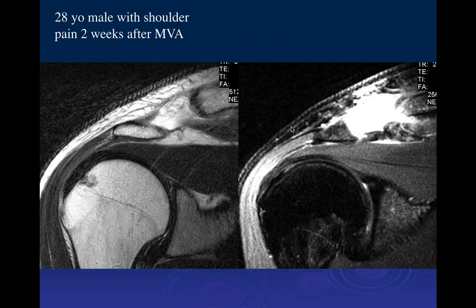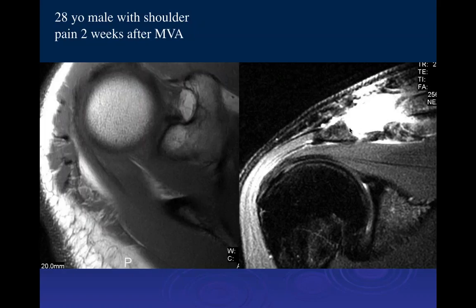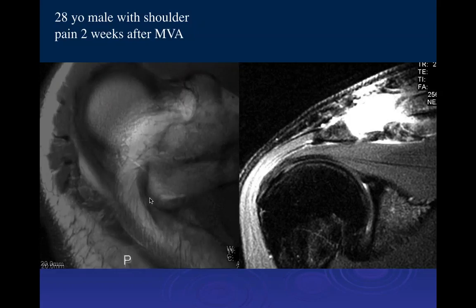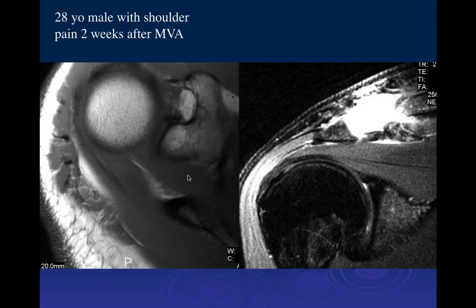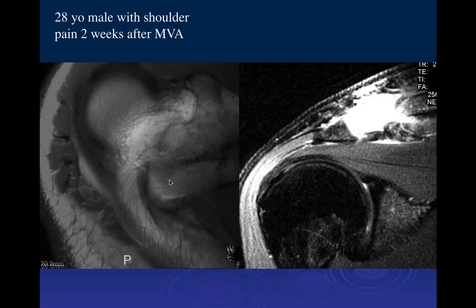There's a lot of edema at the distal clavicle at the AC joint, and on the coronal plane the distal clavicle appears posteriorly displaced. On the axial T1 image, the clavicle appears posteriorly oriented. This constellation — AC joint changes and posterior dislocation with CC ligament disruption — makes this a Type 4 AC injury.